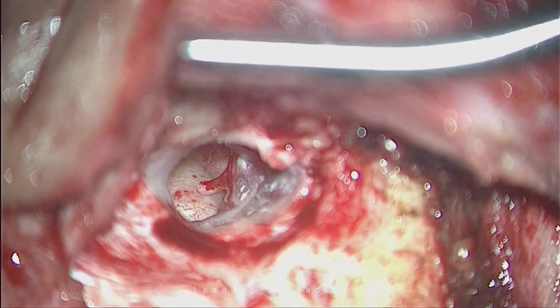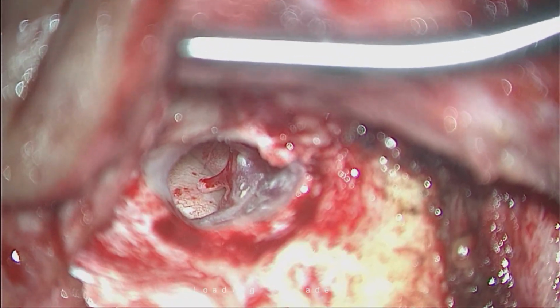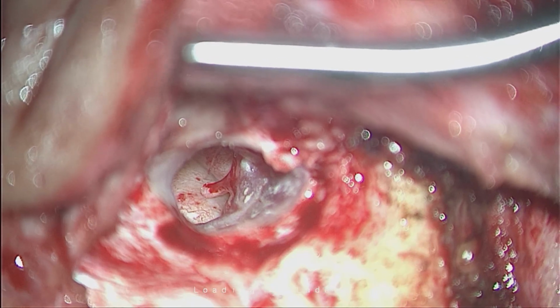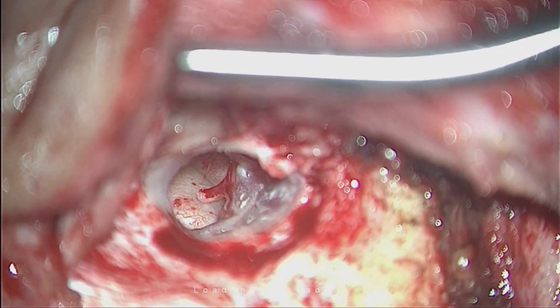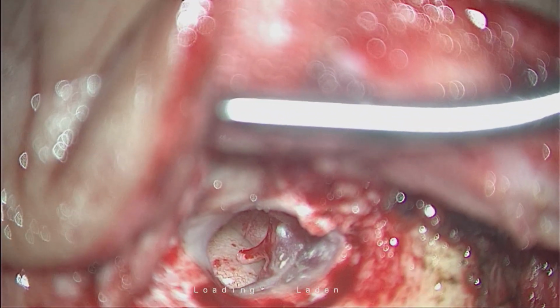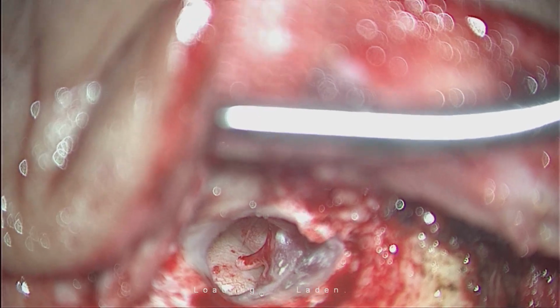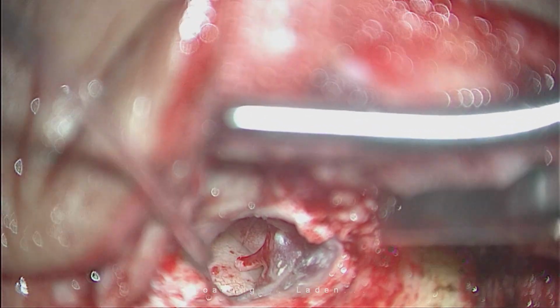dissect the tympanic membrane in between the layers and interpose or graft between the mucosal and the fibrous layer. The outer one is epithelial, then the fibrous and the mucosal, and we will interpose or graft in between the layers. So we need to elevate exactly in between the layers. You should be able to see all the layers as a whole.